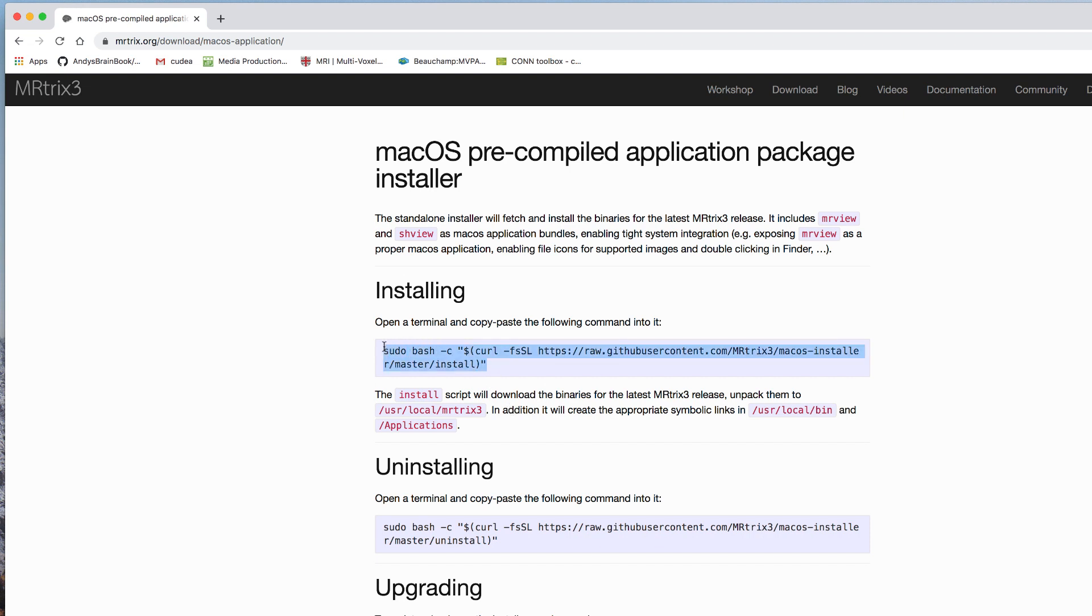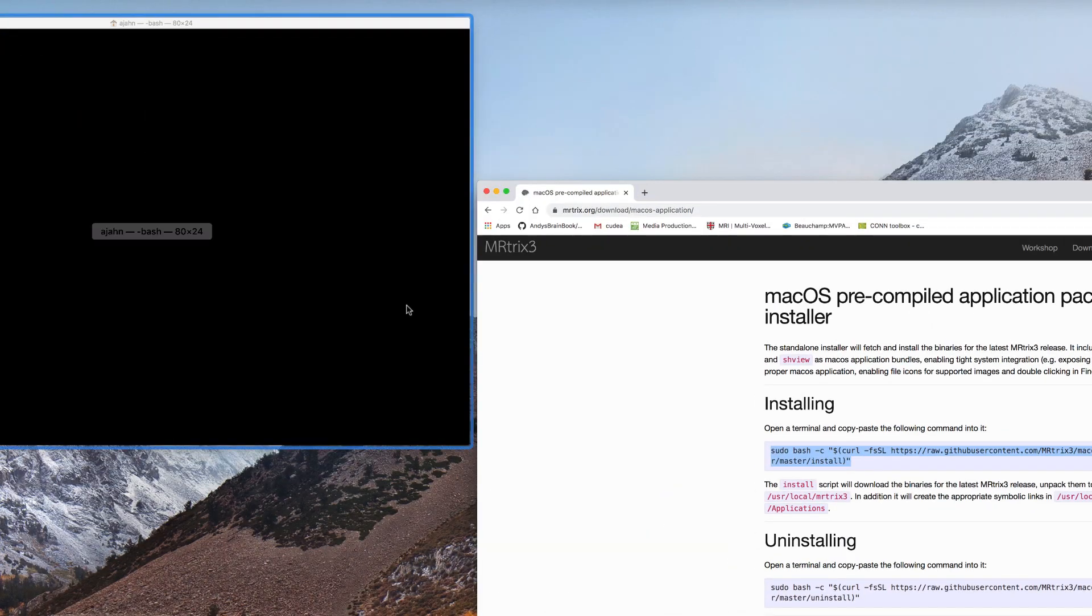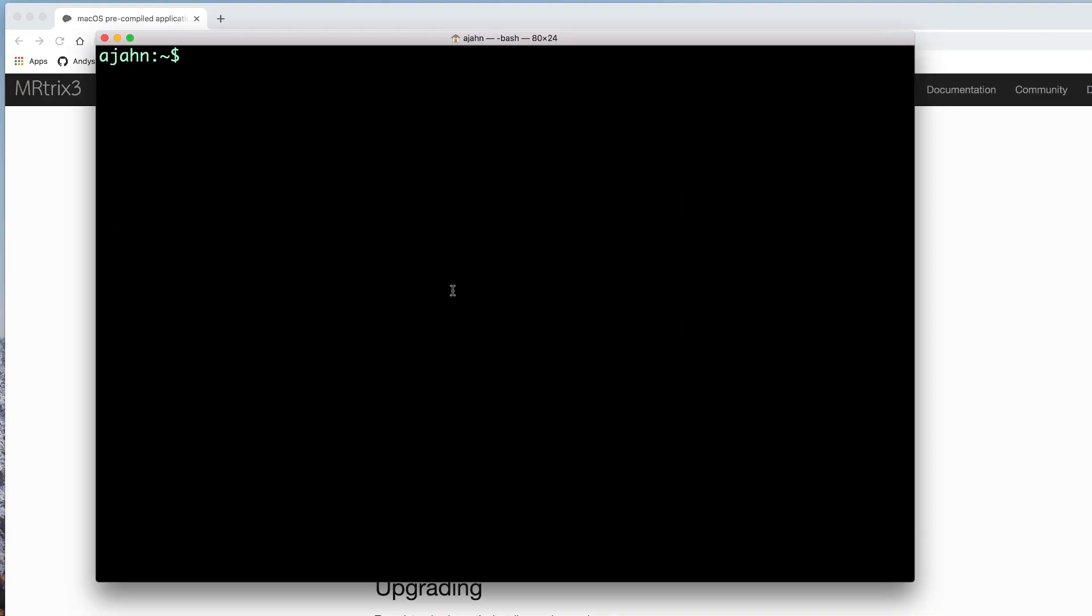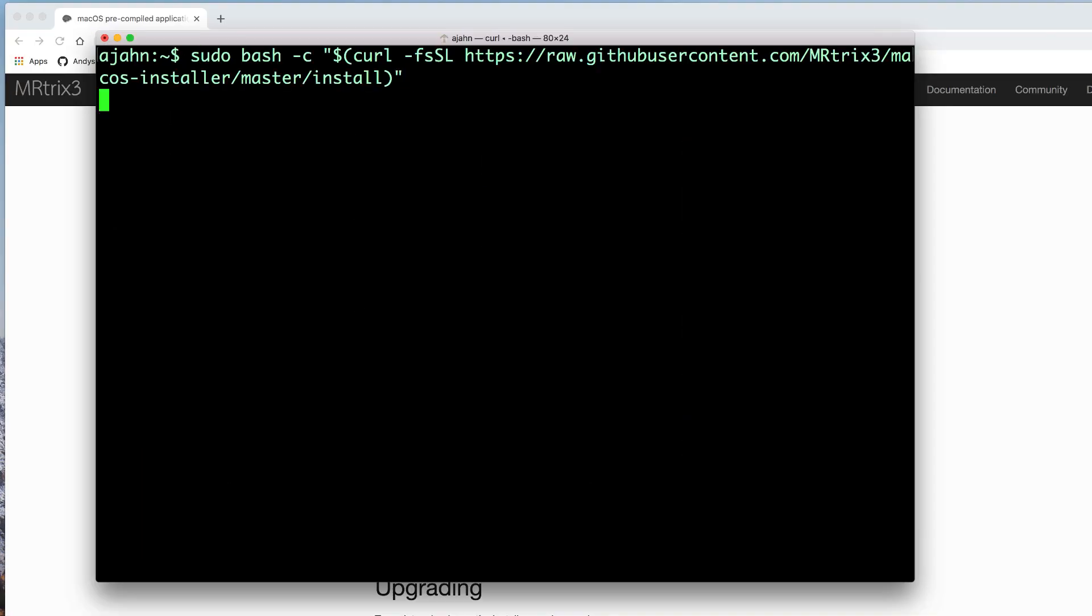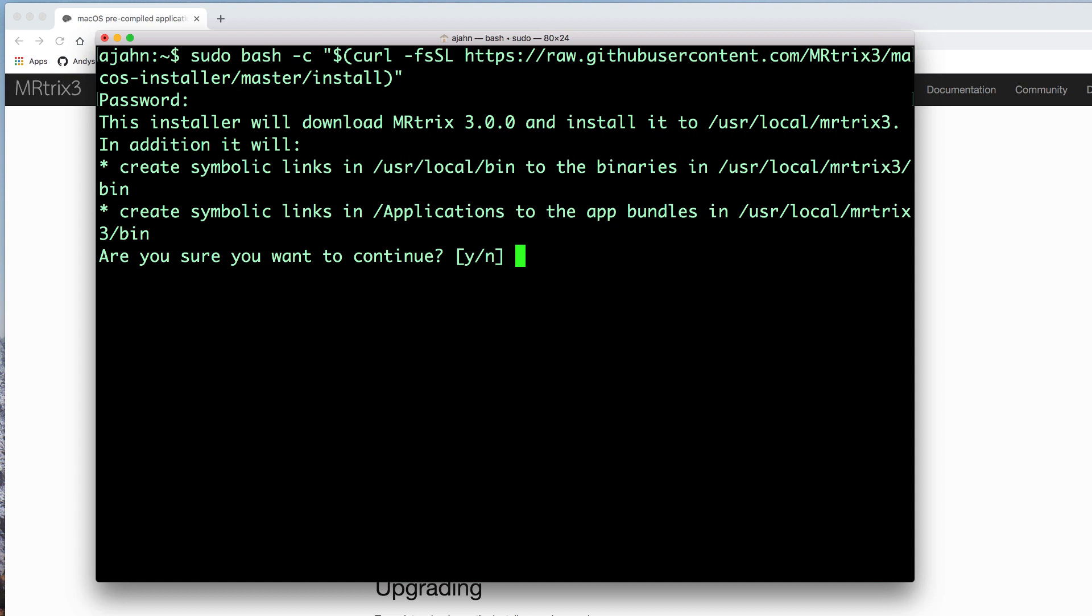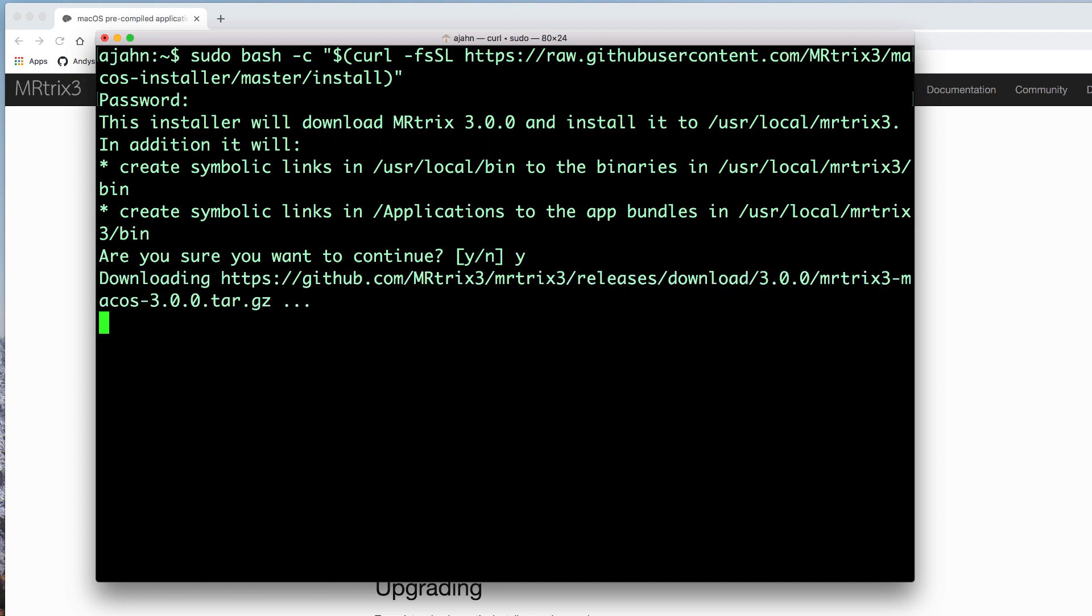Then open a terminal and paste the code into the terminal and press enter. You may be prompted to enter your password. And once you've done that, you'll be asked whether you want to continue, select yes. This should only take a few moments to do.